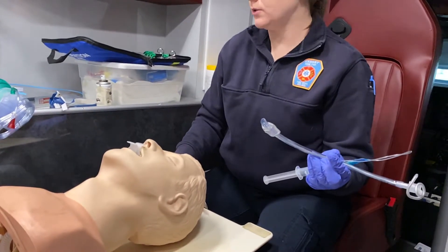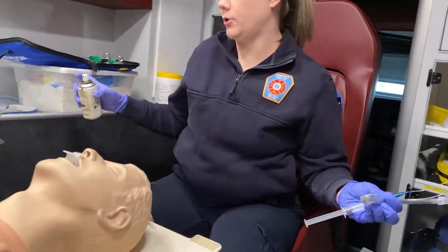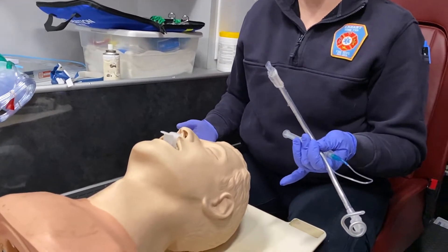You want to make sure the distal tip of your tube is lubricated, so you're going to use a water-soluble lubricant. And then when you're ready to intubate, you're going to direct your partner to stop bagging.